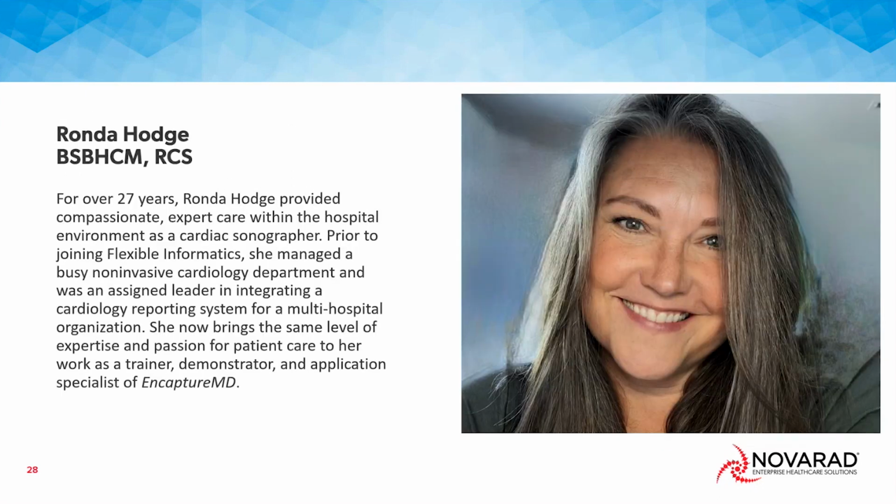Next, we have Rhonda Hodge. For over 27 years, Rhonda Hodge provided compassionate, expert care within the hospital environment as a cardiac sonographer. Prior to joining Flexible Informatics, she managed a busy, non-invasive cardiology department and was an assigned leader in integrating a cardiology reporting system for a multiple hospital organization. She now brings the same level of expertise and passion for patient care to her work as a trainer, demonstrator, and application specialist of Encapture MD.